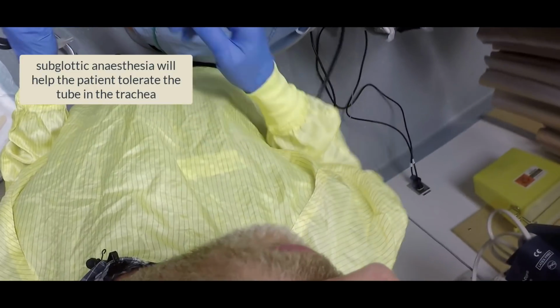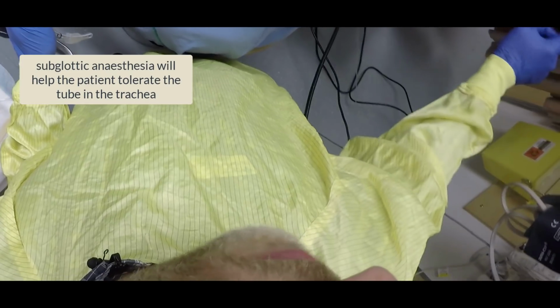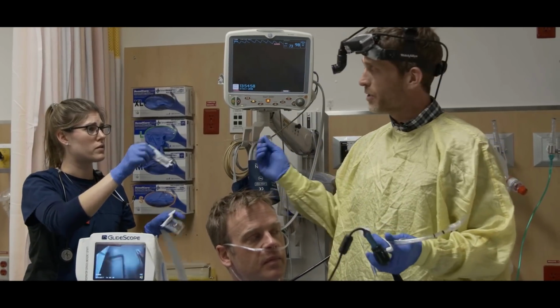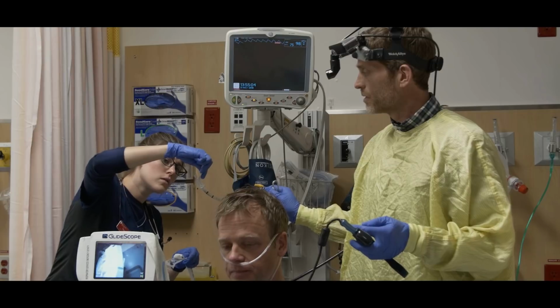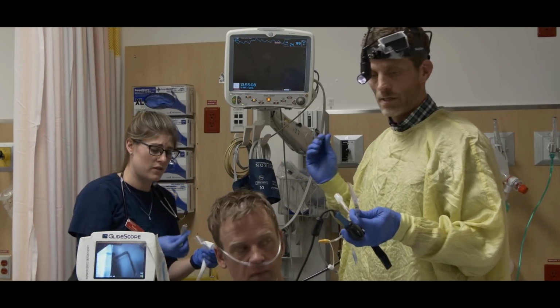How are we doing on time, Leanne? You're at 16 minutes, 10 seconds. Okay. Probably around 25 minutes is where that anesthesia is going to start to wear off. Yes, please. On the tube. Sure. And then take a little bit on the side too. Yeah. That way it comes off a little bit easier.